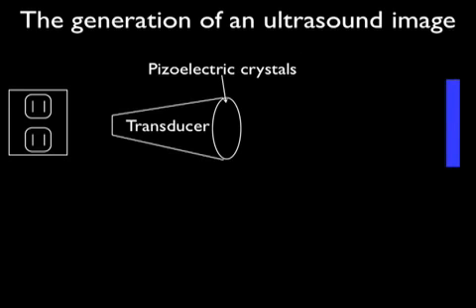Inside each transducer are piezoelectric crystals. When exposed to an alternating current, these crystals will vibrate. This vibration will disrupt the particles in the medium that the transducer is in contact with. This physical disruption of particles through space is the definition of a sound wave.